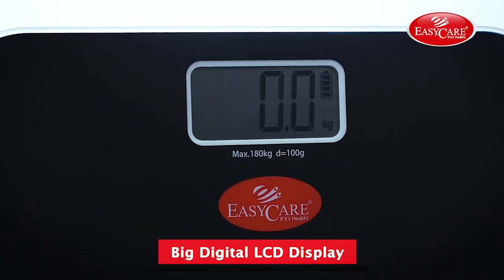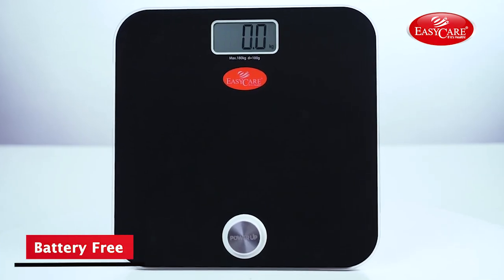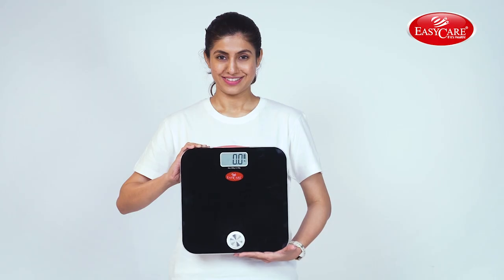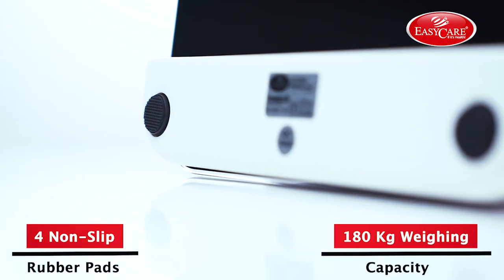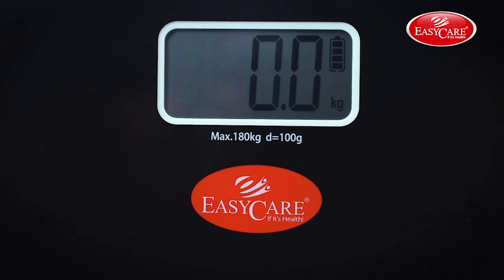The 3-inch digital LCD display makes it easy to read the measurements. It requires no battery as it works only on kinetic energy. This product comes with 4 non-slip rubber pads which prevent it from sliding when you step on it. You can also change the measurement units from pounds to kg or vice versa.